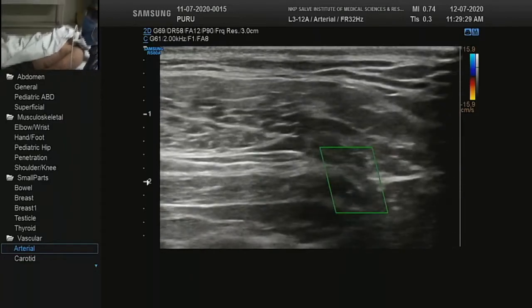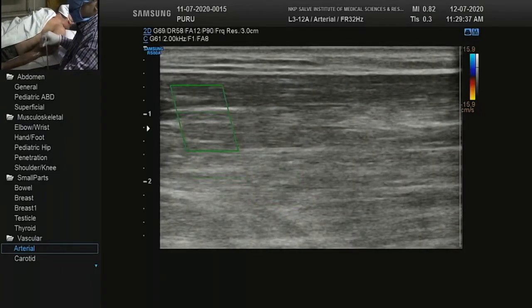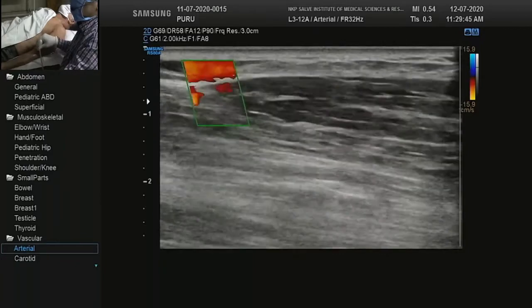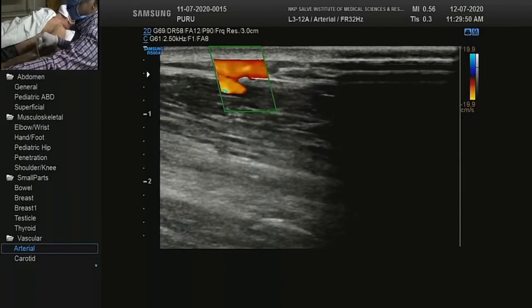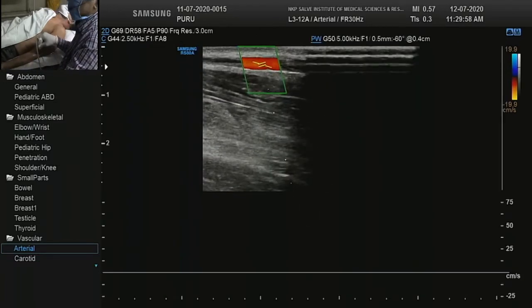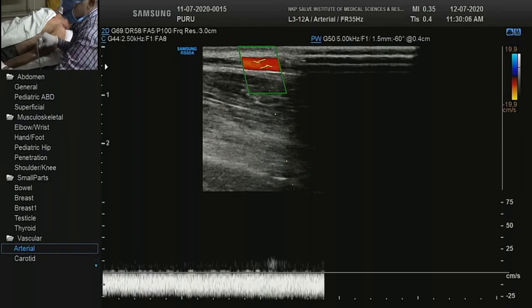Additionally, in the subclavian vein also, in the axillary vein also, because ultimately this vein is going into that vein, and we have to make sure that the flow distal to the fistula is normal. Reduce the color gain here so that the color remains within the vessel. This is the cephalic vein at the proximal arm, and just do a spectrum, a good flow.